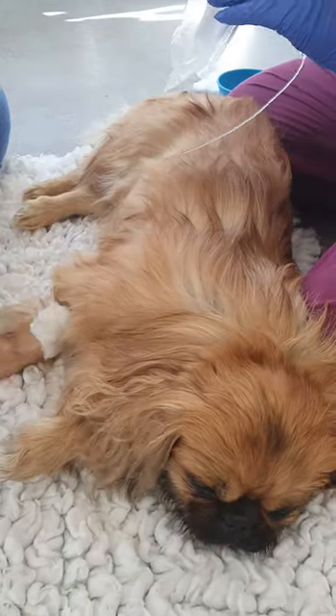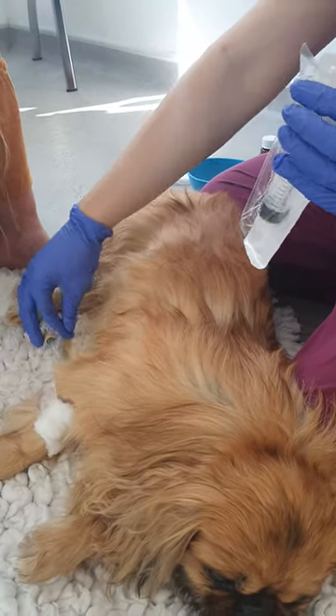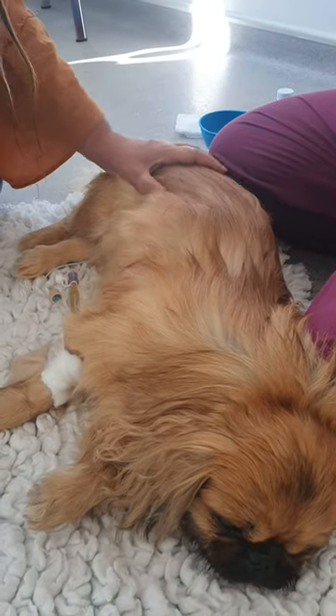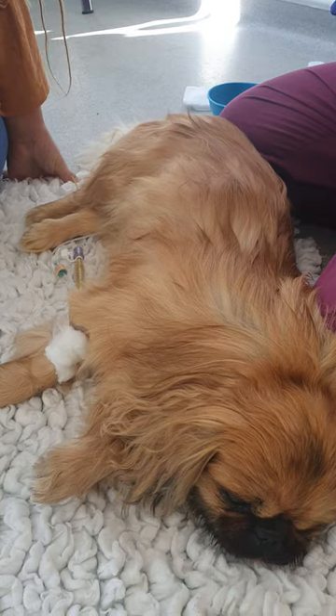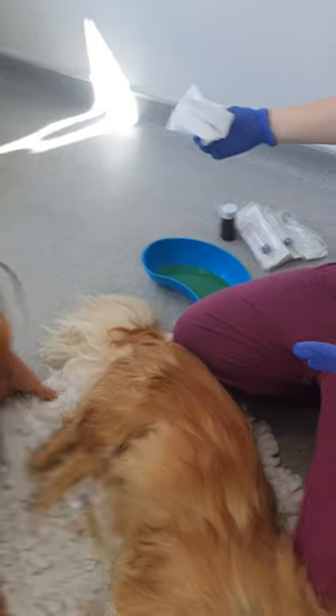Then we'll pop the syringe just back into there, like that. You can just use cotton wool and things. I've got plenty of stuff like that at home anyway.